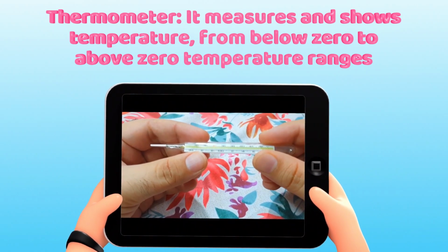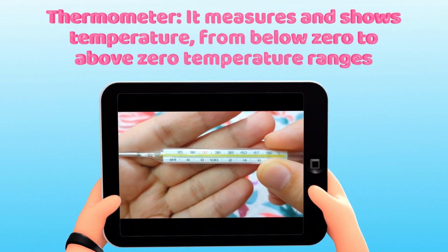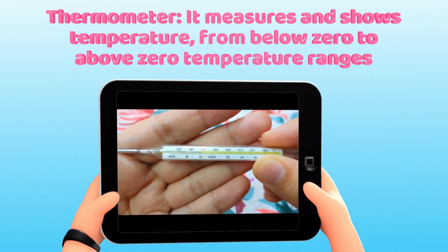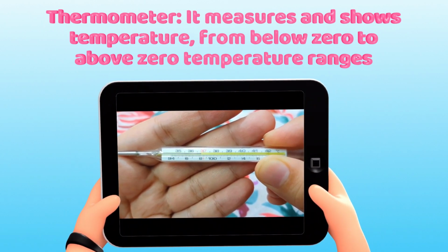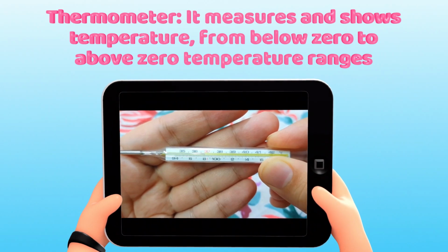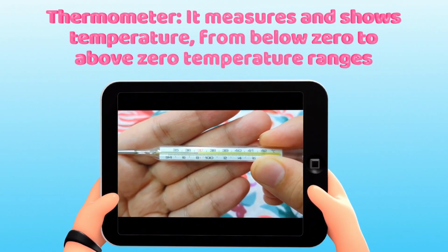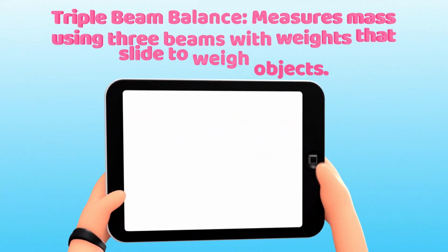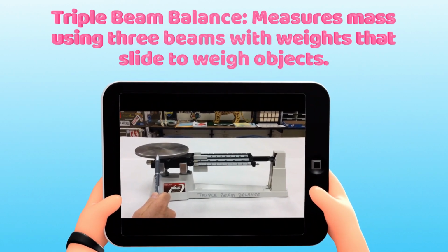Before putting it, it was 0, but now, for example, it reads around 98. If it reads 98, it means you are normal, 98 Fahrenheit. But if it is above the red line, then you are having a fever. That's how it operates.